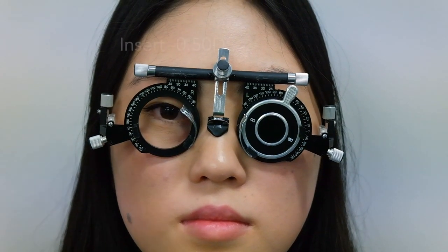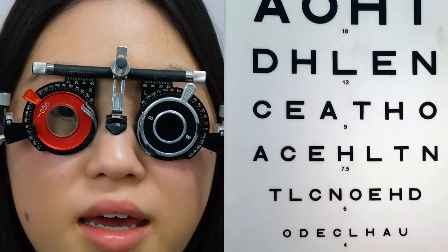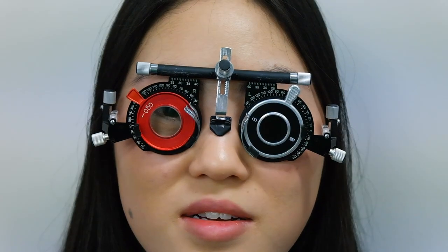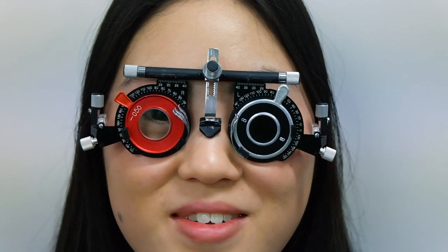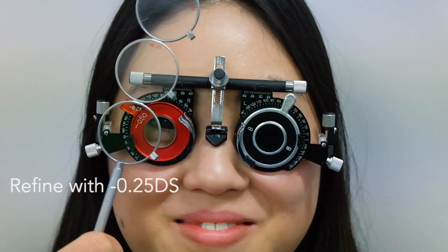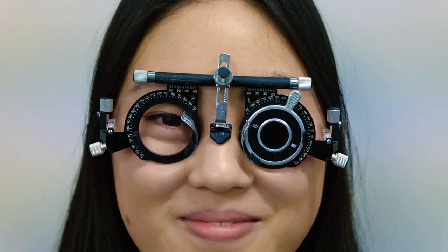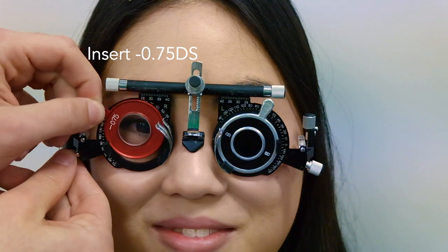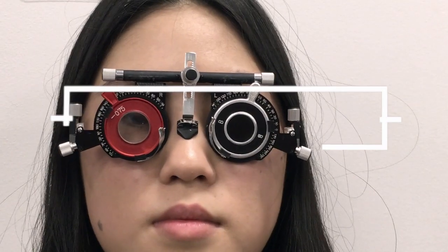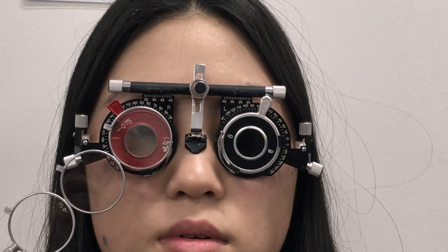A lens is placed in front of the right eye and the patient reads down the chart. The sphere is further refined by presenting lenses and asking the patient whether vision is better with or without. The patient confirms it is better with the lens, and the sphere power is adjusted accordingly.